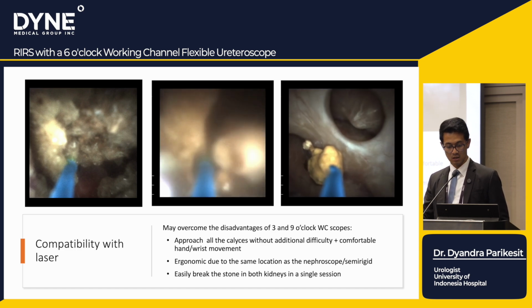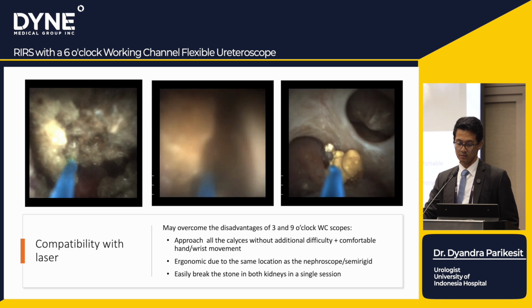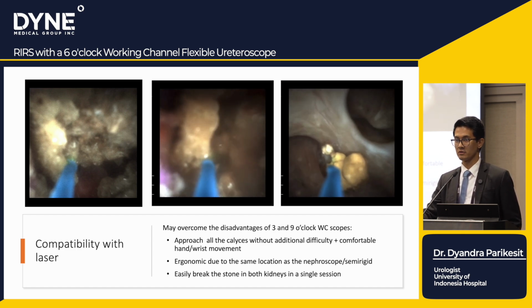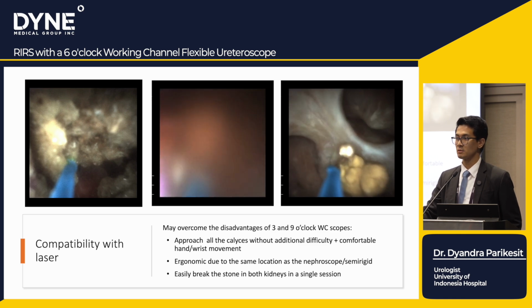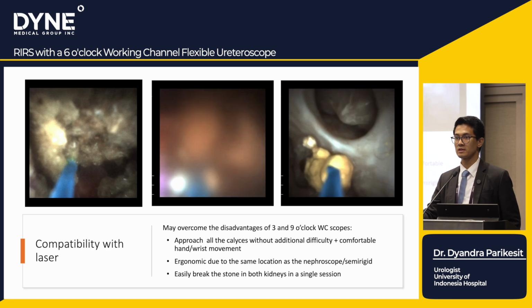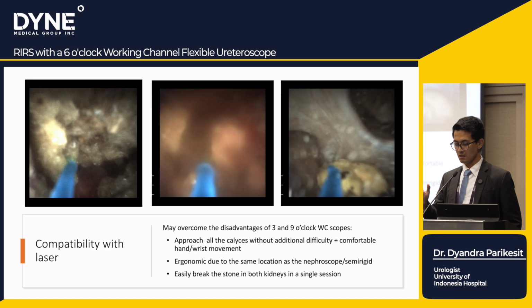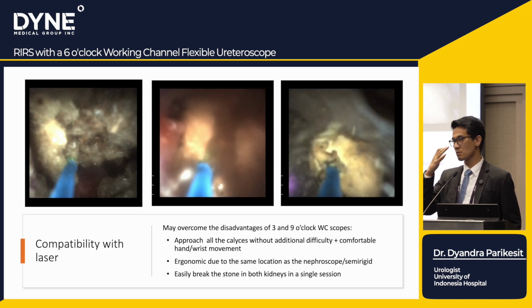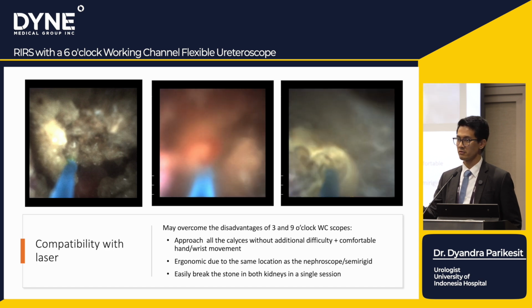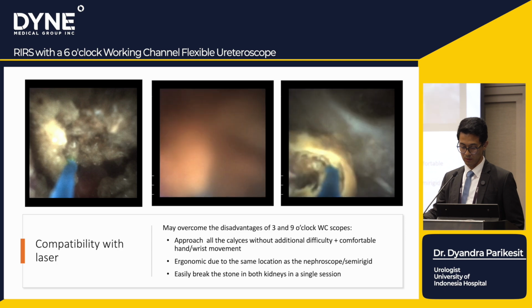As you can see, the rightmost part is my resident handling the scope. This is his 4th time ever holding a flexible URS, but his first time using the 6 o'clock. Because it's similar to a semi-rigid or a nephroscope, it's very easy for him to get used to it and adapt.